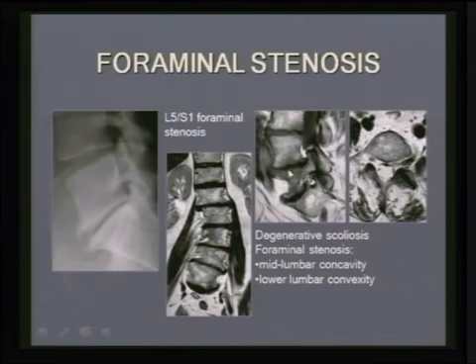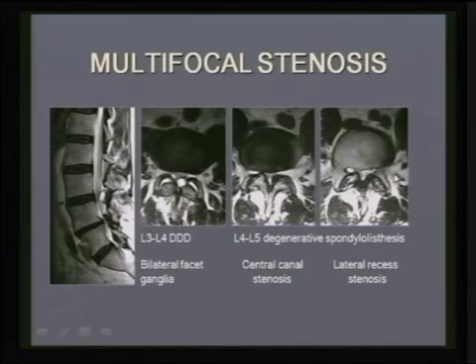And this is the left side of the curve in this particular patient, where the L5 nerve root here is being trapped by the bulging disc, as you can see here, both on the sagittal and on the axial images.